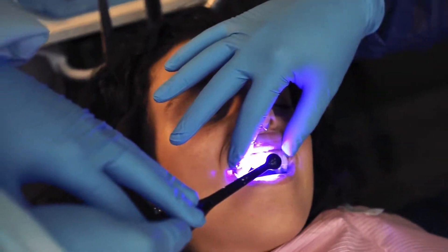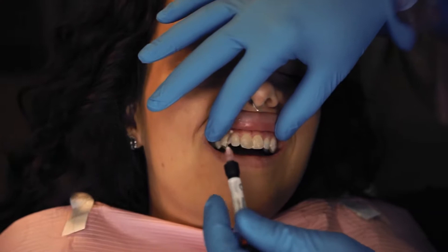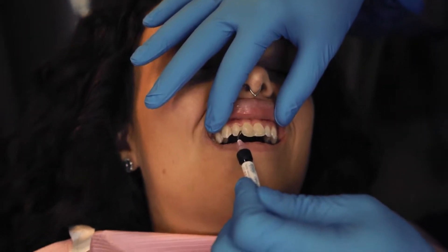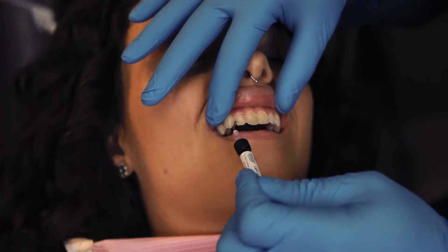Usually we can make these outside of her mouth. Sometimes when you have a case and you don't have the luxury of taking your time to make the wax-up, we do a mock-up. It gives us a general prototype of what we're going to try and do with her veneers.